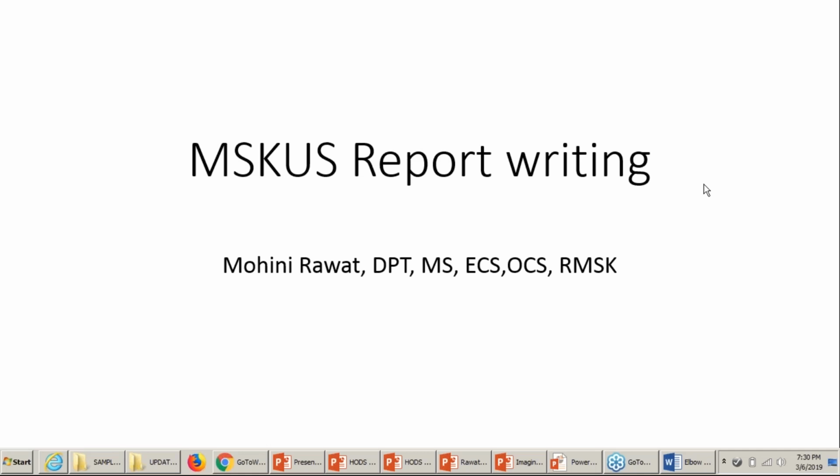Tonight's webinar is on new updated ultrasound templates and also on report writing. I'll be showing you the changes that I've made and some case examples and practice some report writing with those case examples.